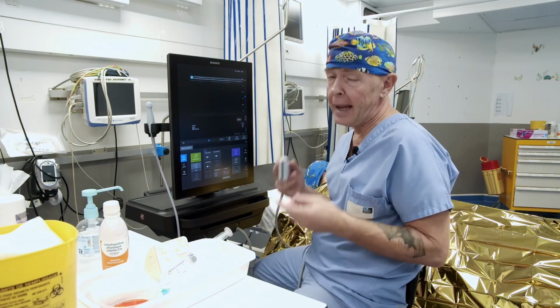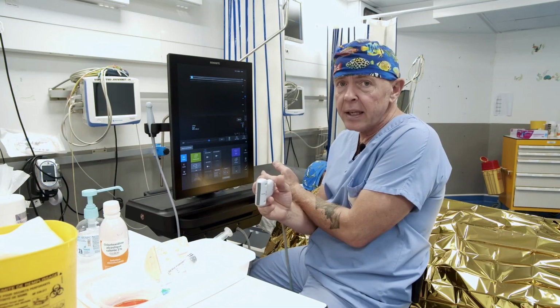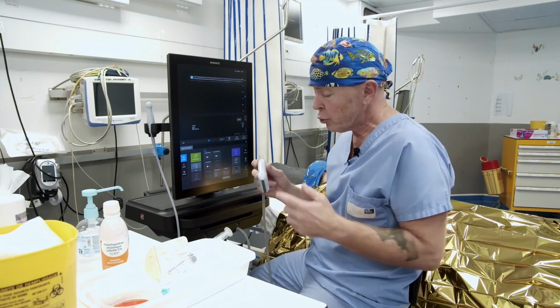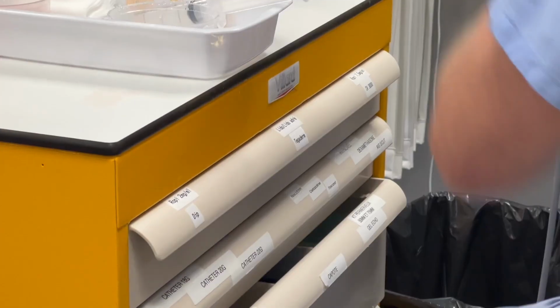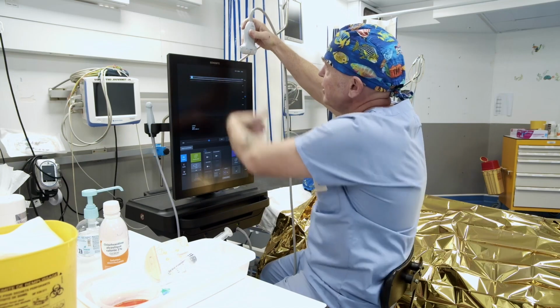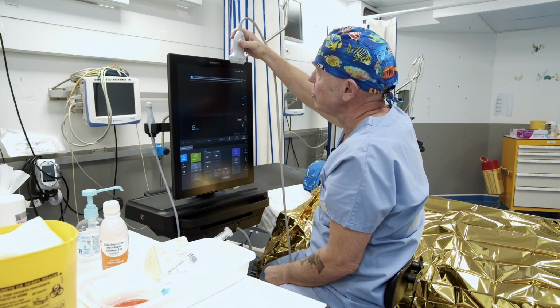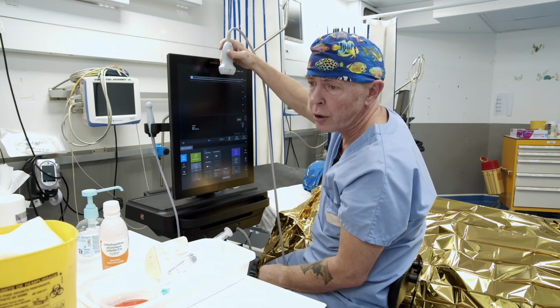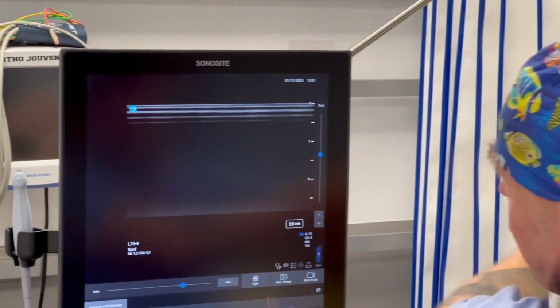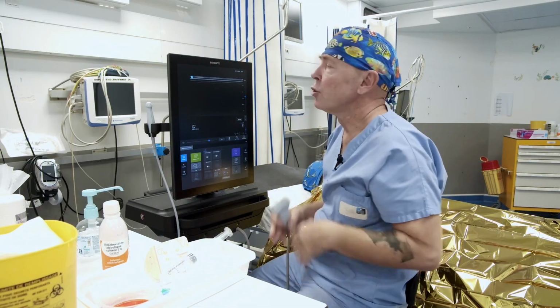Therefore, step number 5, ergonomics. Frequently, I observe individuals administering injections with their arms crossed, turning around, or not fully aware of their positioning. As I mentioned earlier, I personally ensure to inject from the side of the probe marker, which directly corresponds to the screen. To help you visualize, the screen corresponds to an ultrasound display. So when I insert the needle on the side of the probe mark, the needle will always appear. And if I perform a block on the contralateral side, I turn my probe, use my other hand to insert the needle, imagining I'm on the other side, like this. I use my other hand, and the needle will always appear on the same side of the screen.